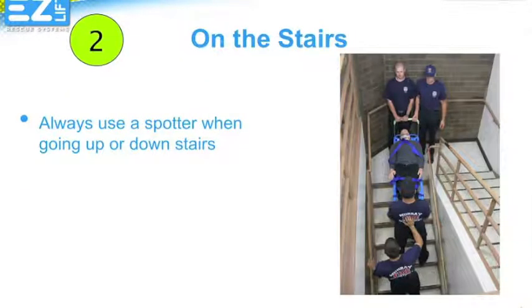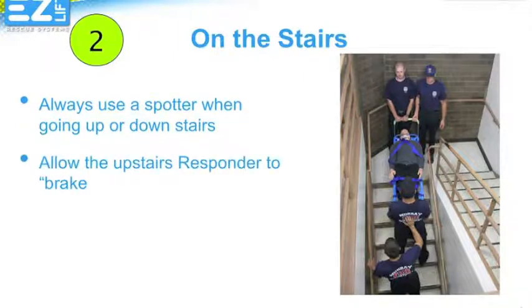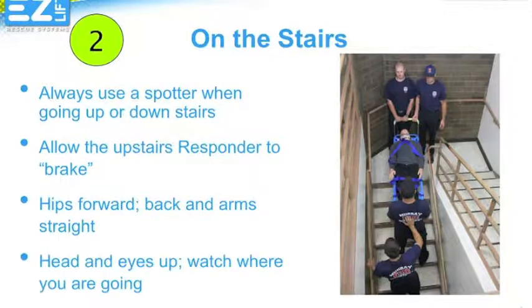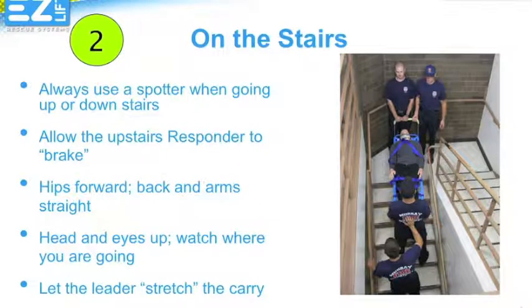Always use a member of your crew as a spotter downstairs to guide the carry. It is safer to use three people to carry and the fourth as a spotter to ensure everyone's safety during the carry. On the stairs, the upstairs responder acts as the brake, making sure the pace is measured and consistent. Always keep your hips forward, eyes up, watch where you're going, and allow the leader to stretch the carry, almost as if you're being pulled gently along.